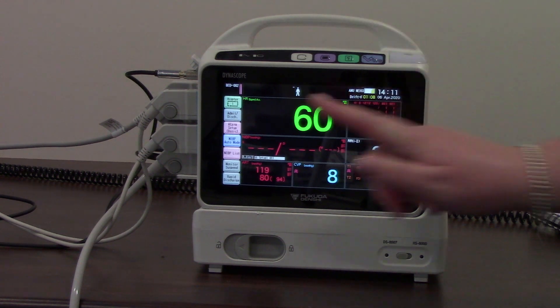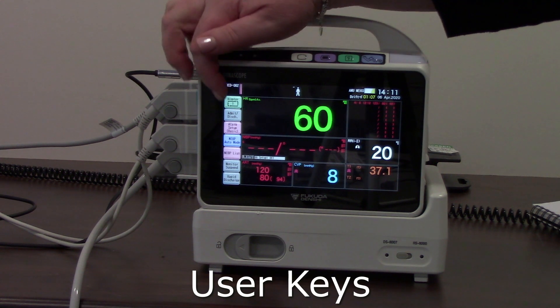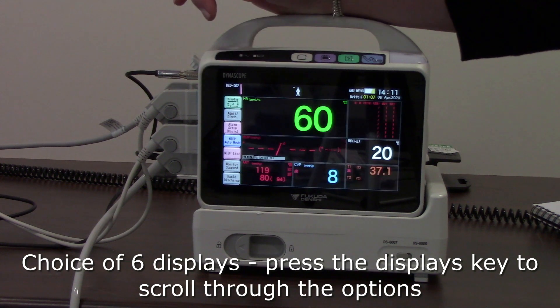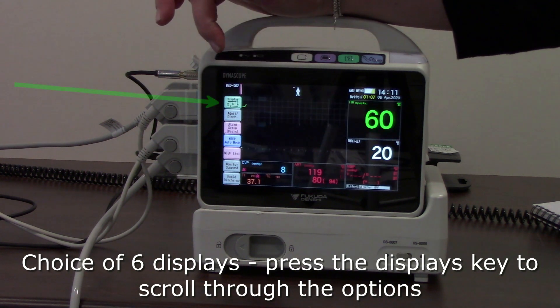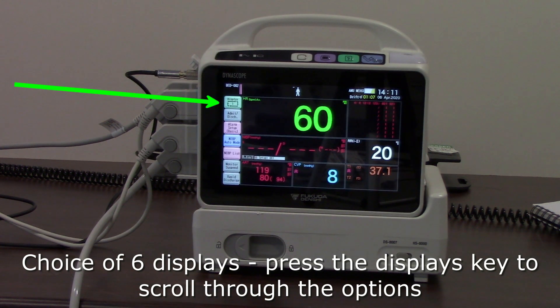Pressing the home key, we'll have a look at the user keys down the side — these are customizable, so they may be slightly different depending on how your monitor has been set up. We have a displays key with a little number on it. You can just keep pressing it and you'll see the display changing with each press, cycling through different displays — different parameters, maybe larger or smaller — until you get to a display that meets your patient's needs or that you prefer.